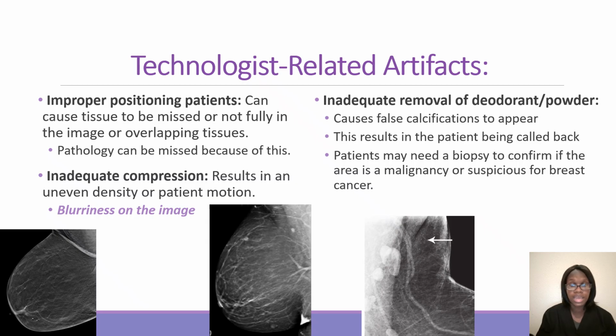If you have been trained and you're still in a stage where you're unsure of how to do, let's say, an MLO view, or you're having problems with your implant patients, go get help. You can also attend an online webinar where they show you different tricks on how to position. I also have videos on my page as well. You can also take a positioning class to help with this.